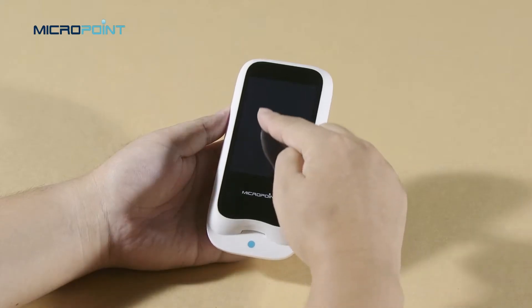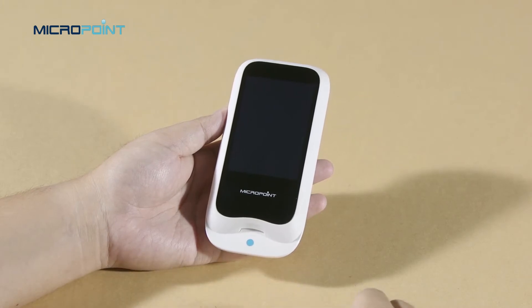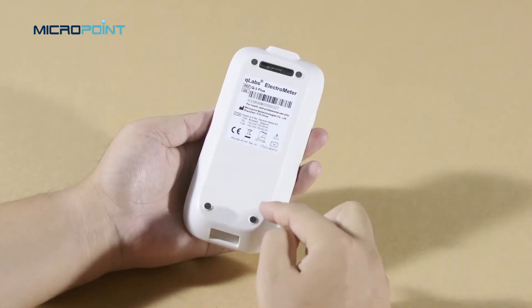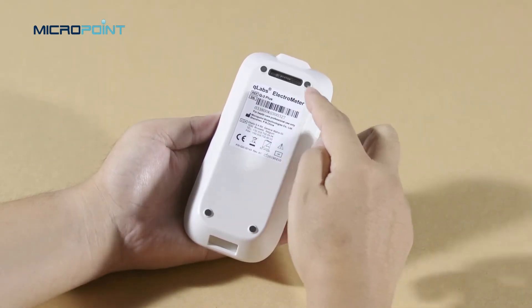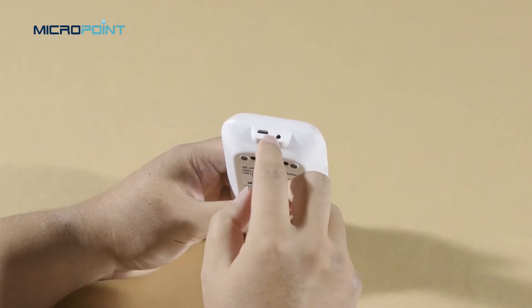In the front, we have a touch screen and the test strip guide where the test strip will be inserted during testing. On the back of the meter, we have the battery cover, the footpad, and the magnetic charging port. At the top, you will find the power supply jack and the data port.